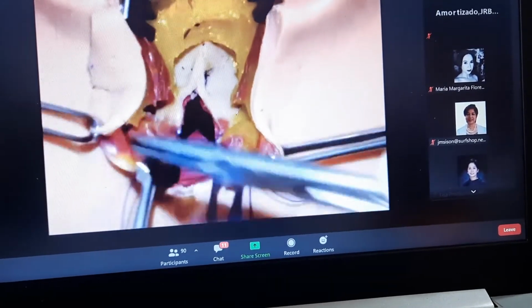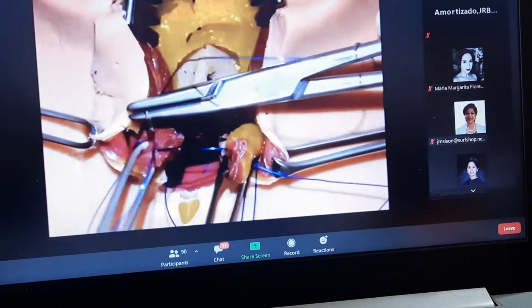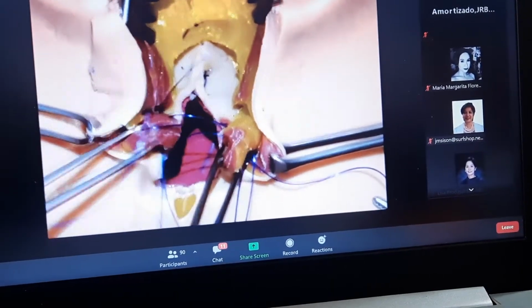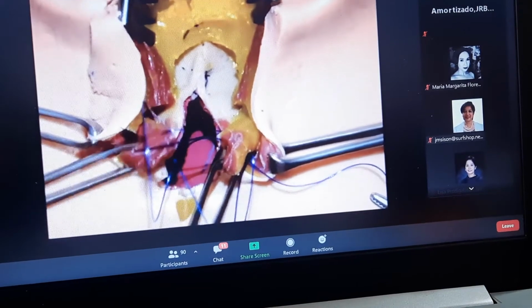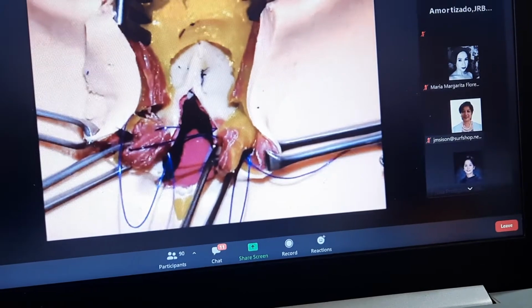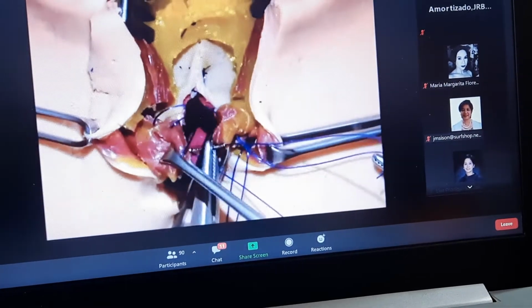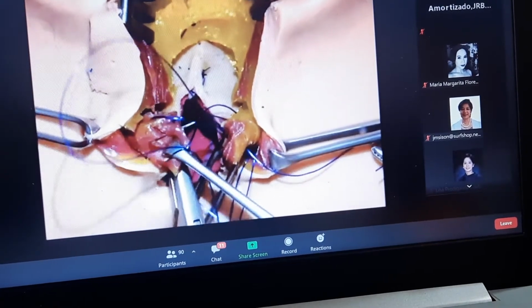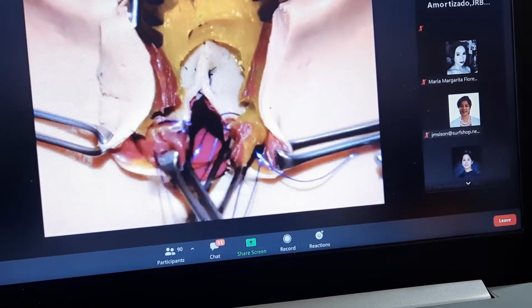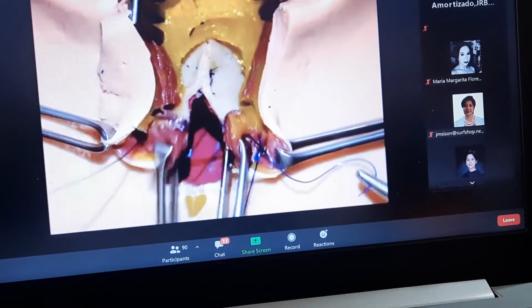And then proceed this time with suturing the more medial edge. Now the second suture will be the more medial. You start off with the more medial edge of the left torn end of the external anal sphincter and overlap it by suturing through the more lateral edge of the right end of the external anal sphincter. The goal is to overlap like so.